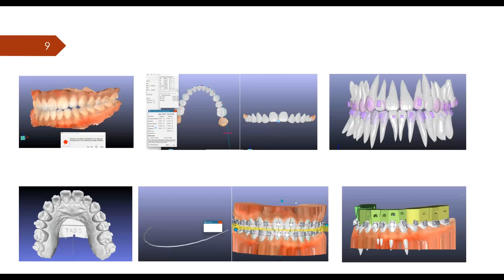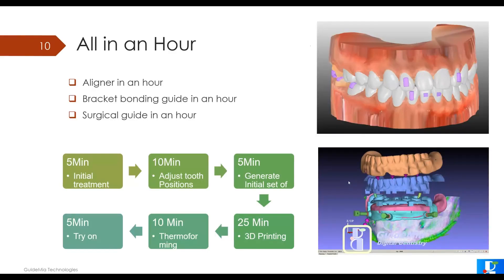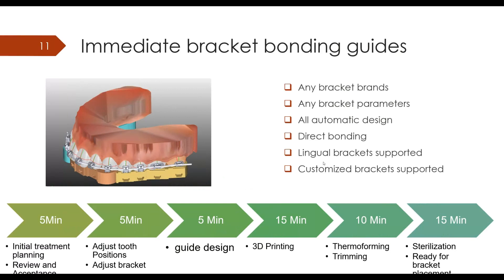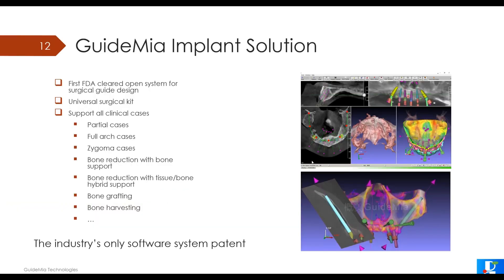We also have a bracket bonding approach — a direct bonding approach where we generate a guide to put on the patient's mouth. You don't need to do any extra work except printing. With our latest software, we can help labs and clinics perform treatment planning and design models for aligner manufacturing within an hour. We can do the same for implant surgical guides — we have all the functions needed for implants. A similar process applies to bracket bonding. We have some slides for implants, but that's not our focus today.